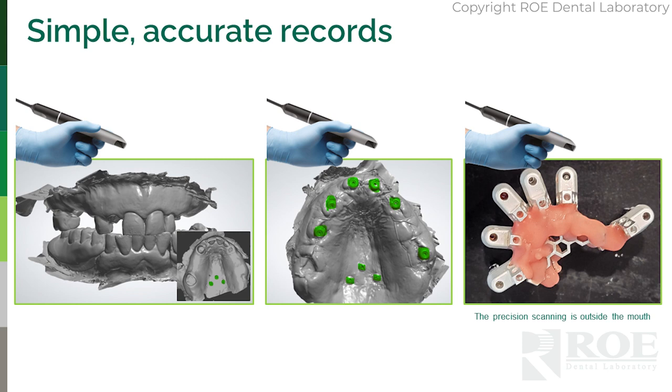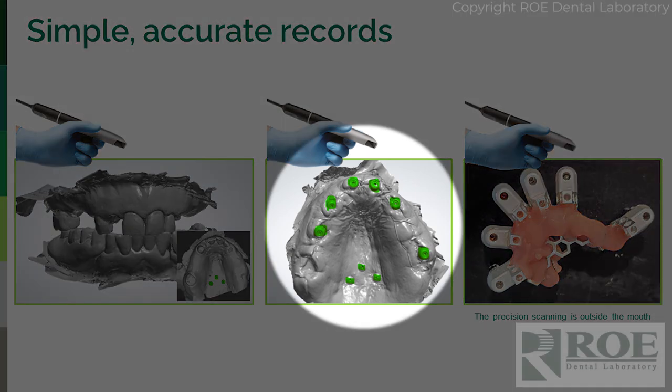All right. So, screws are in, patient is scanned. Now, you go through the entire surgery, all the way until you have the multi-unit abutments in the mouth and you perform the OptiSplint luting in the mouth. We'll discuss that. But what I really want to convey here is that these are the three simple records. You're going to scan the full arch. You're going to capture the healing collars in sutured tissue with the screws. And those are the two intraoral scans. And your patient is done.